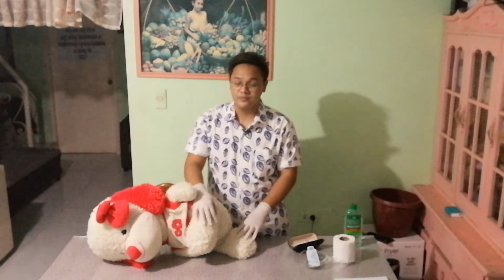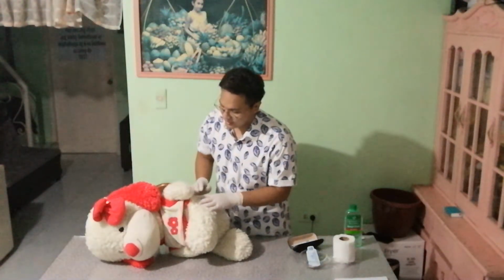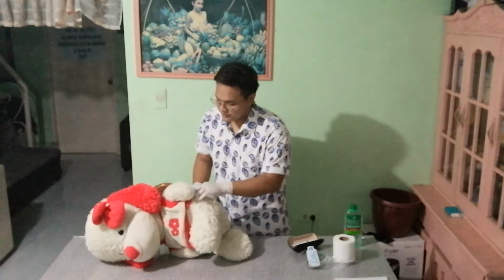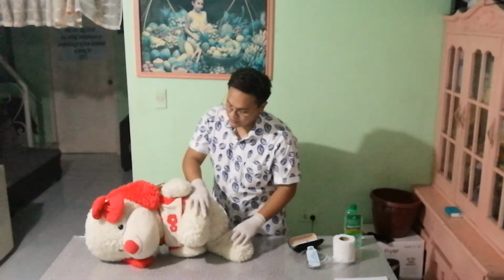The next one is we need to pull back the cover enough to expose the buttocks. Ma'am, I will now remove this portion so I can see your buttocks area.